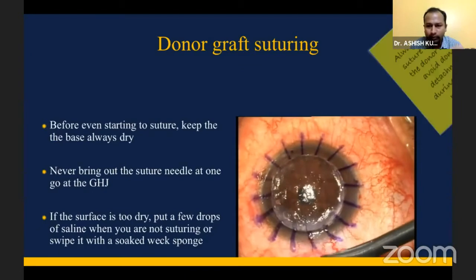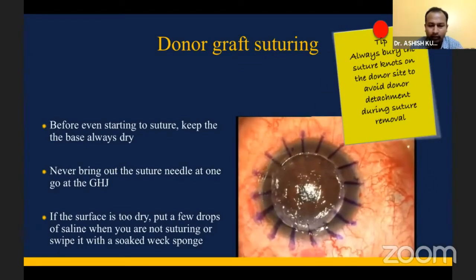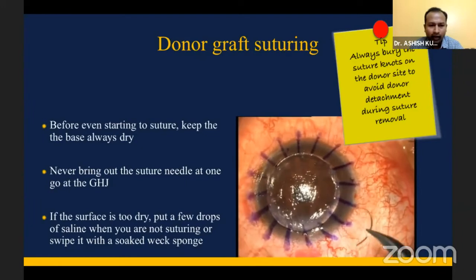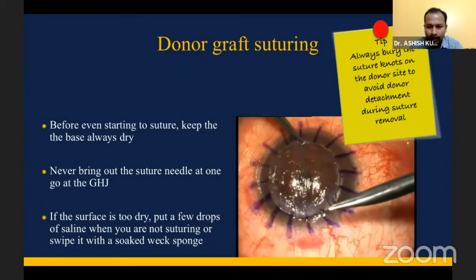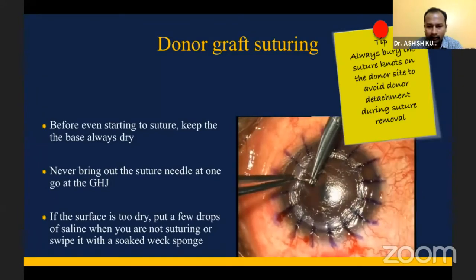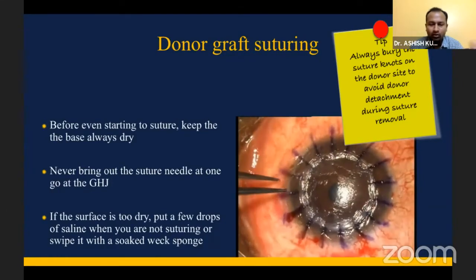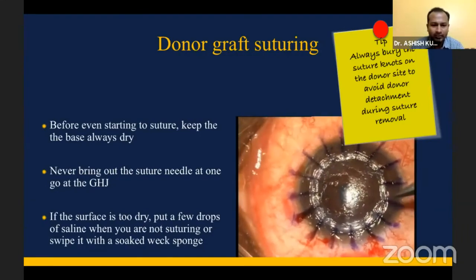Again, a very important tip while suturing these DALK cases, because most of the time perforation happens in these steps. Once you have taken the bite, don't come out at once. Like here, you'll see I'm going with the suture needle, holding it. You have taken a bite there, and then one, two and three. So don't come out at once, because the back end of the tip may perforate the Descemet's membrane.